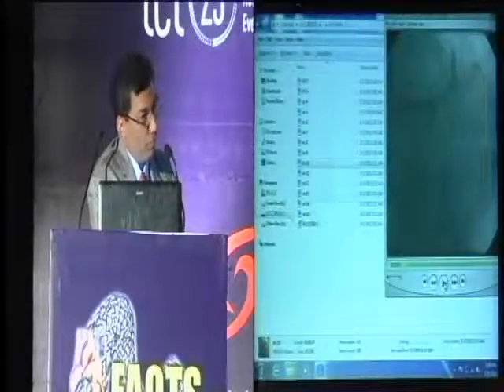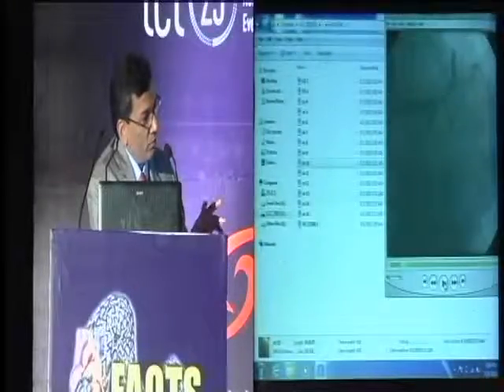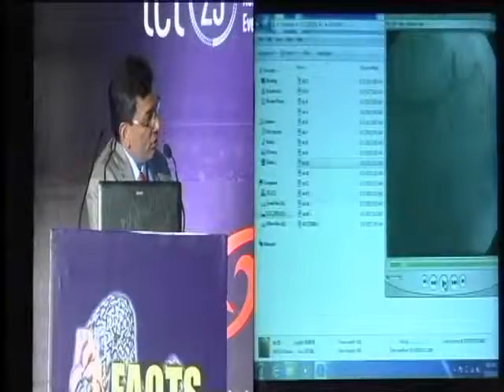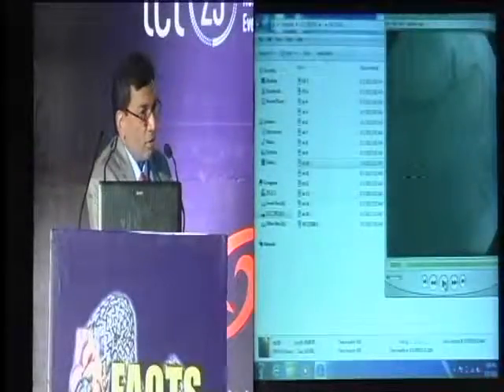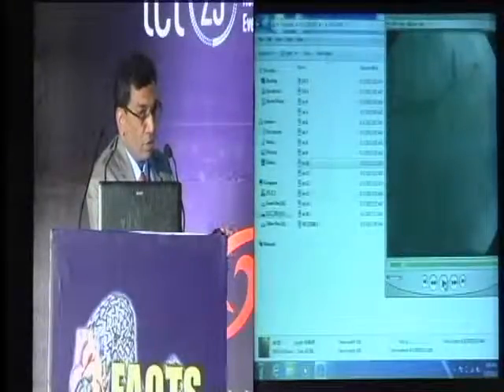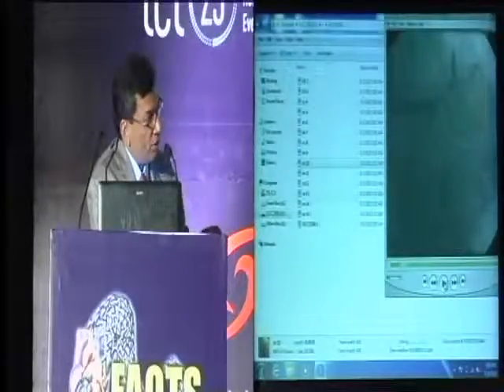The key in bifurcation stenting is to get a good view of where the diagonal origin is and the angle of bifurcation. In this situation, the diagonal was the more important vessel because the unstable lesion was more in the diagonal, and it's an equally big vessel, so we decided to stent the diagonal, not the LAD.